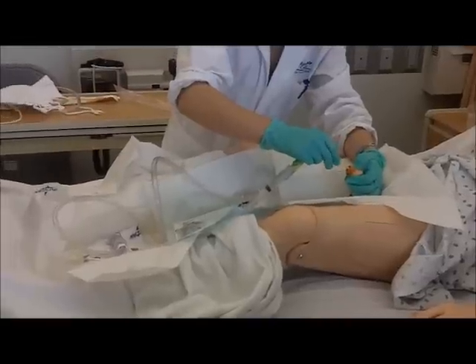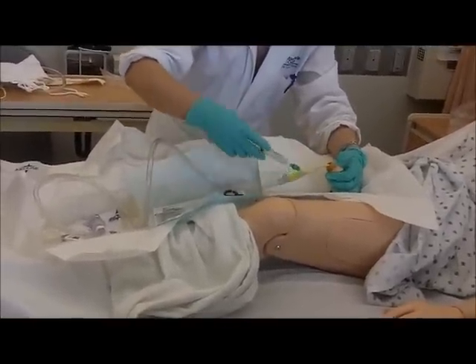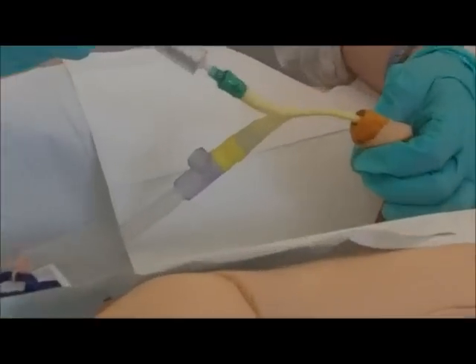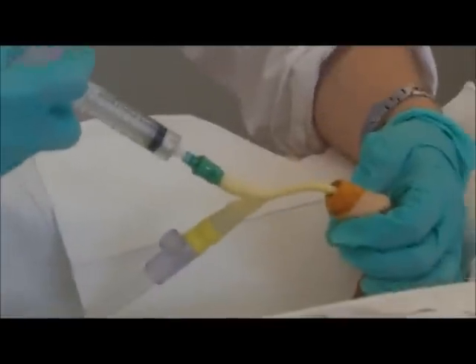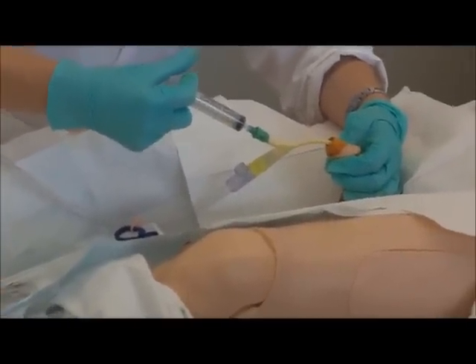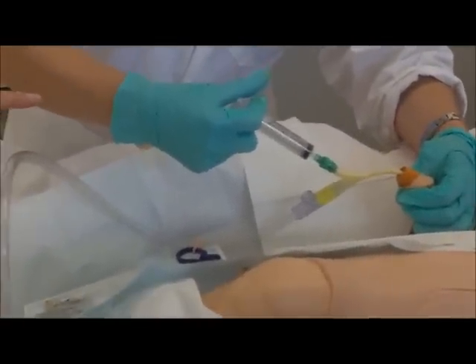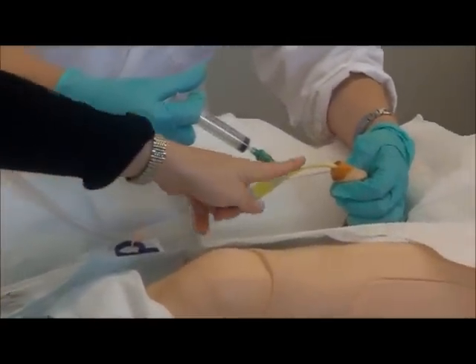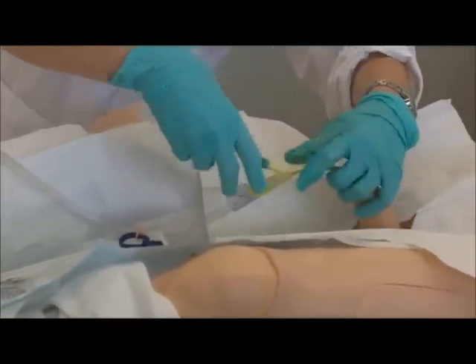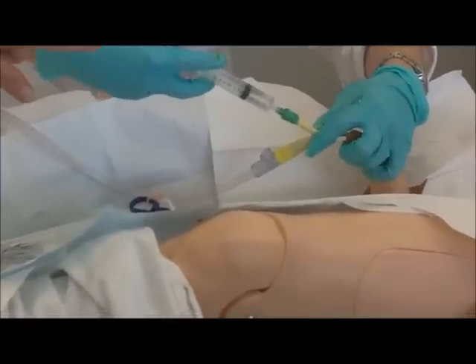Do you see how it goes in better and it's not flipping all around? That's much better. And after that I need to inflate my water — the whole thing. These lower locks are a little difficult because they're not screw-ons. So you have to kind of support with your other hand now — the green. You can touch here or touch there with your dirty hand. Dirty the other one — because you're just taking it off now. See if you don't — if you let it go, that's what happens.